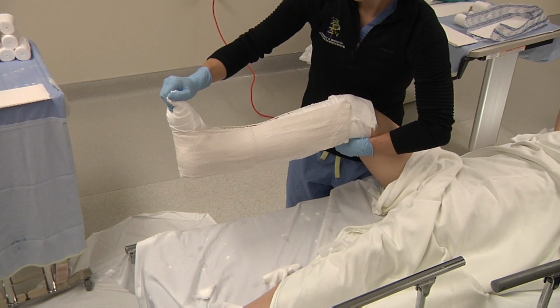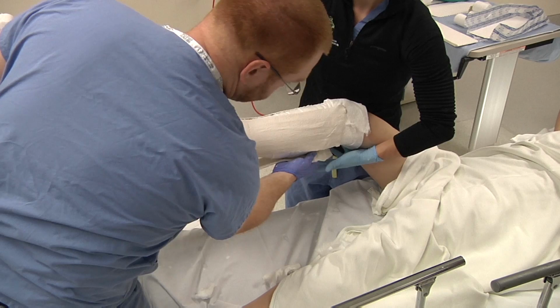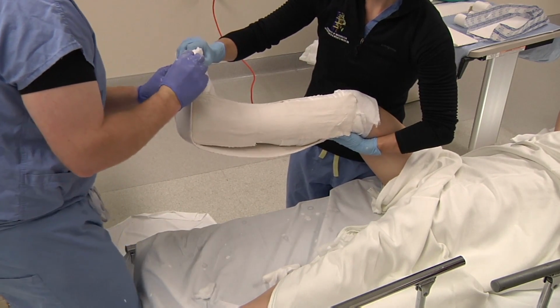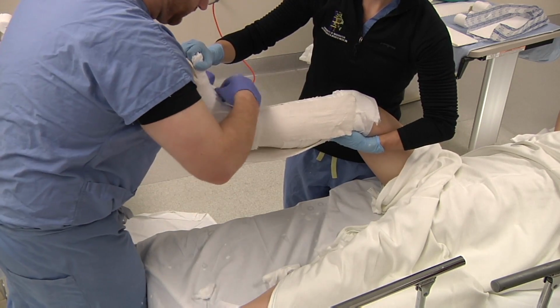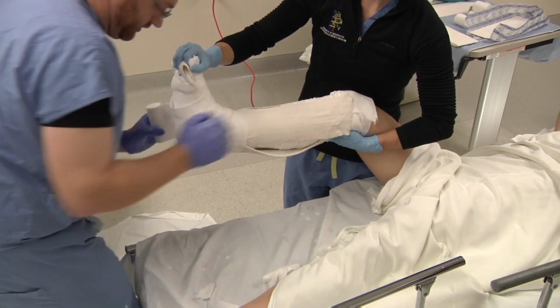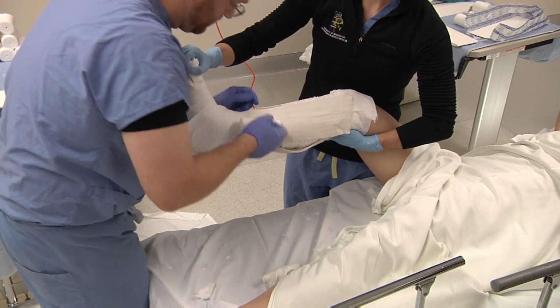Posterior slab, which is of course 10 thick as compared to the 5 thick ply that we use for our medial and lateral stirrups. Making sure that doesn't extend into the popliteal crease. Bring it up to the end of the foot. As we do in our short leg, it's helpful to wrap over the plaster to aid in its removal when it comes time in the operating room.